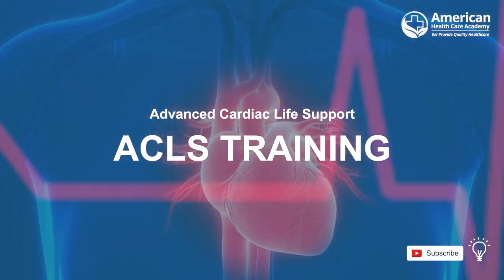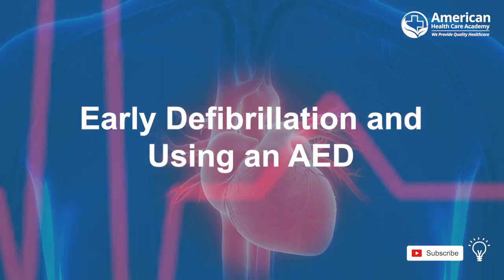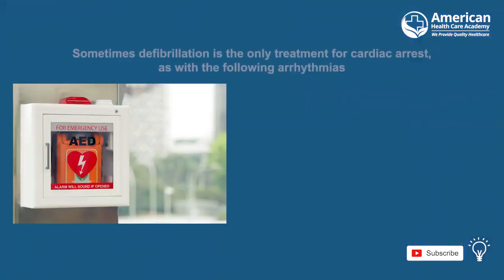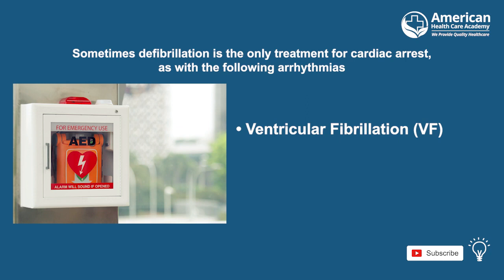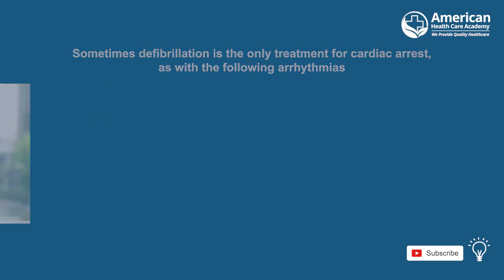Welcome to the Advanced Cardiac Life Support chapter on early defibrillation and using an AED. In a situation where a person goes into cardiac arrest, sometimes defibrillation is the only treatment that can restore normal heart activity. This is the case when the rhythm is irregular, as it is with ventricular fibrillation, otherwise known as VF, and pulseless ventricular tachycardia, or VT, both of which will be discussed in detail in the following chapter.